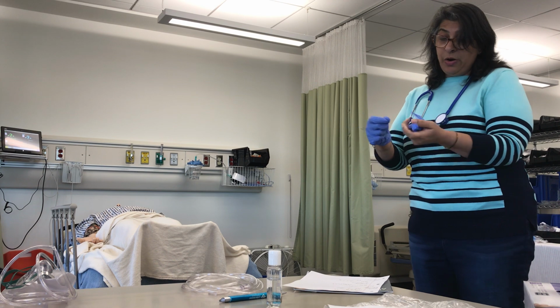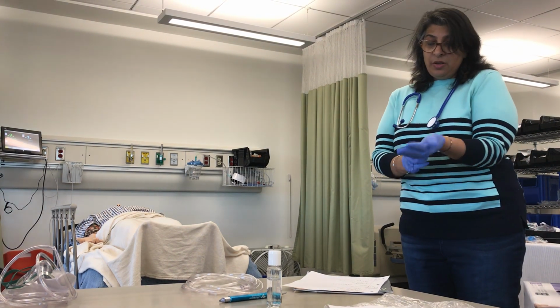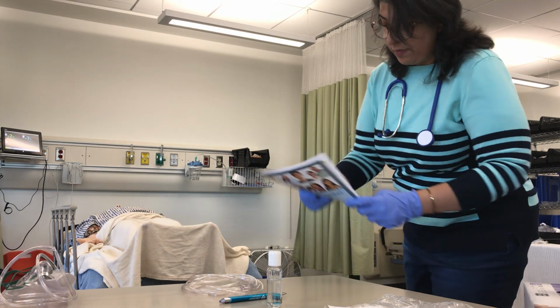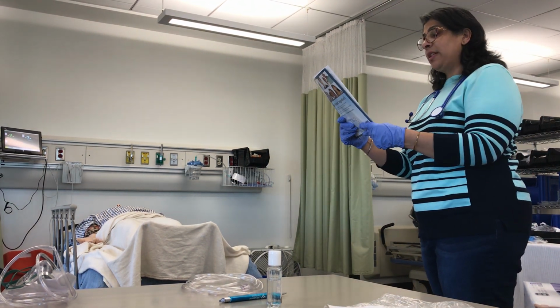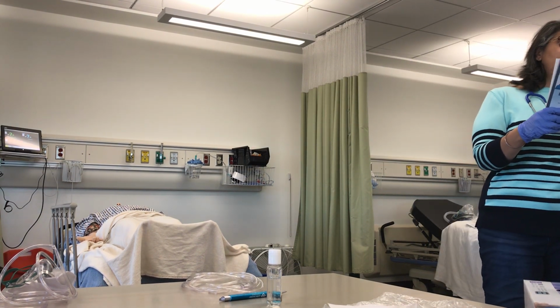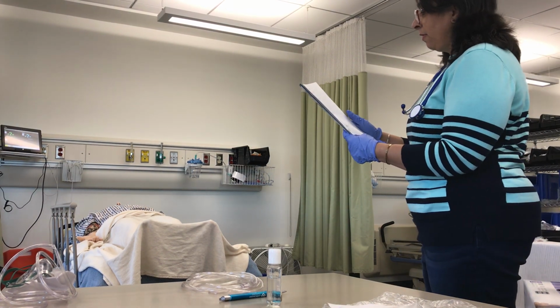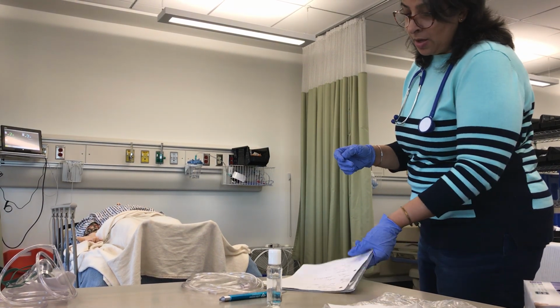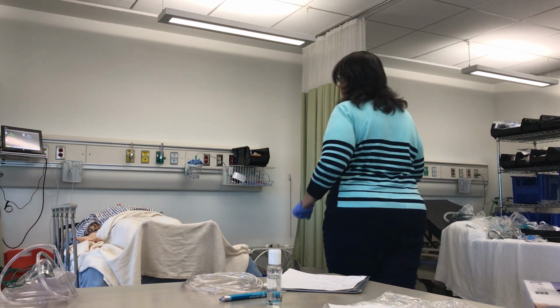And I already did my hand hygiene. Okay. I'm gonna verify my orders and see what my MD orders are. I'm supposed to keep my SATs greater than 90%, and he is slated for Q4 albuterol treatments, 2.5 milligrams via nebulizer. Okay, so I'm gonna go in and go knock knock.